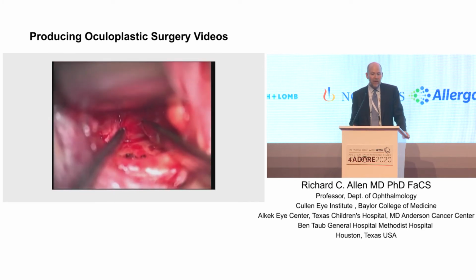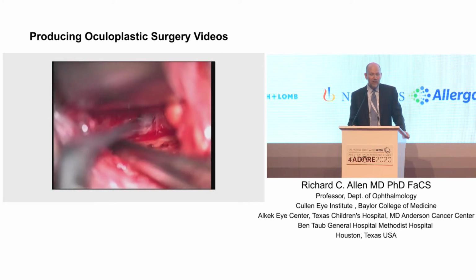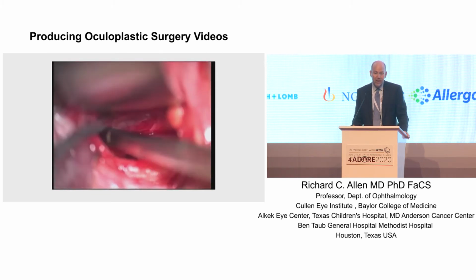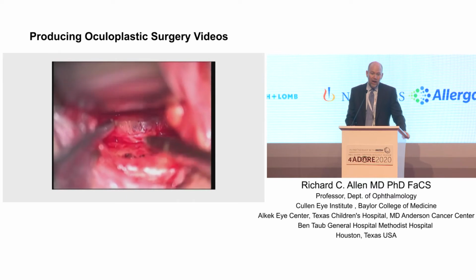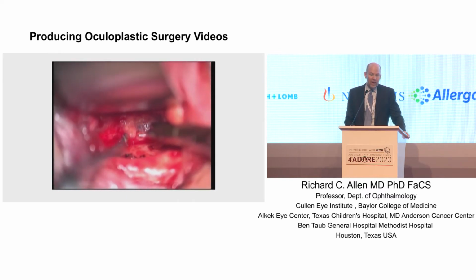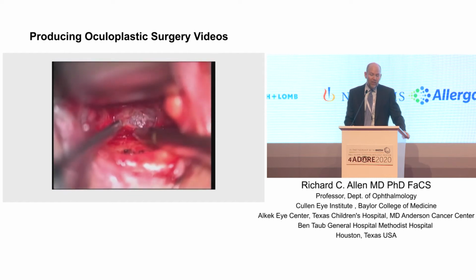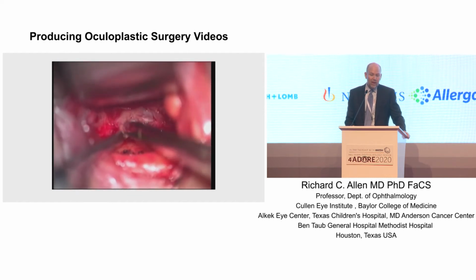So this is a vascular malformation in a patient, and I'm using the microscope. So the nice part about this is that I no longer have to worry about getting into the way. My camera, what I'm seeing through the microscope is what is going to be seen on the video. So it's really, really nice with regards to that.